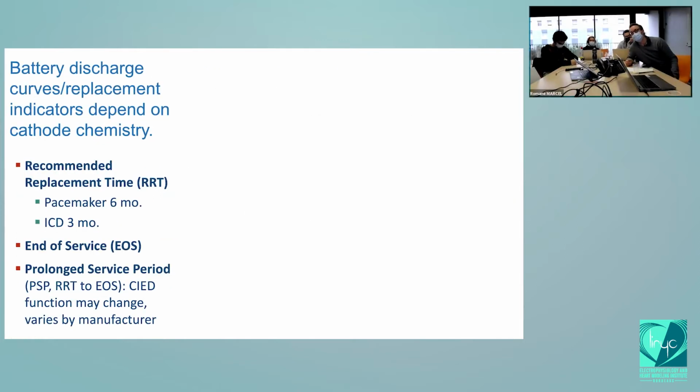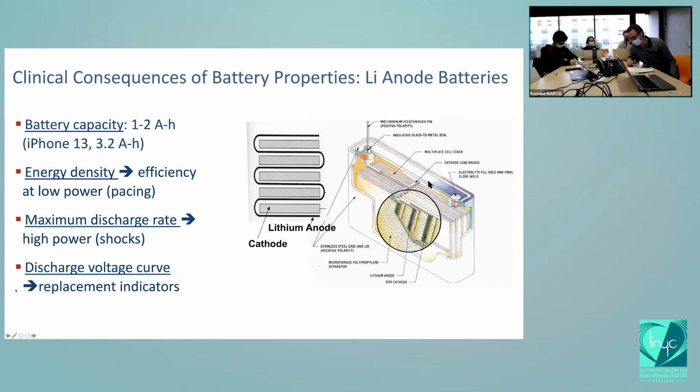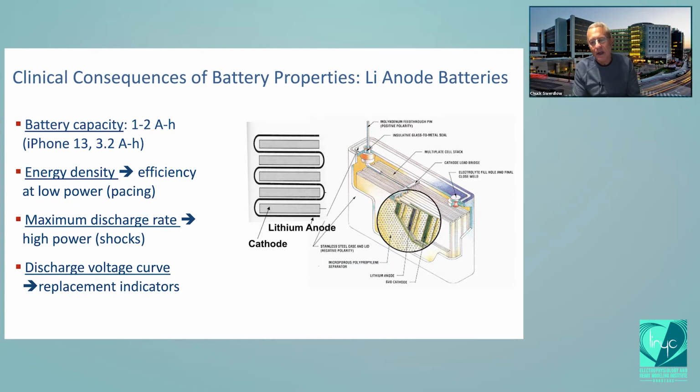Is this the current problem that the SICD batteries have, the sudden drain of battery, the recall? That's a really good question. I have to look that one up. I don't remember the reason in SICD.